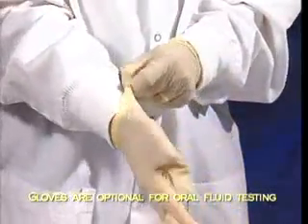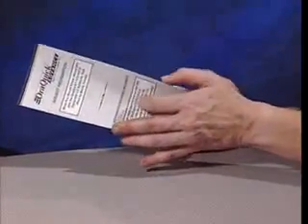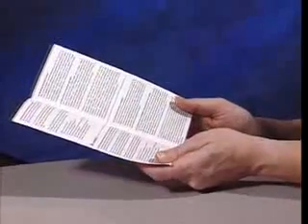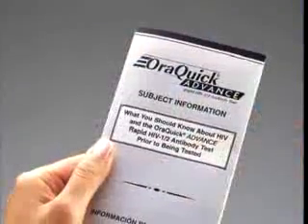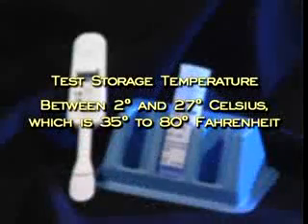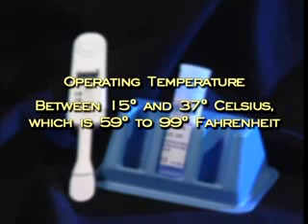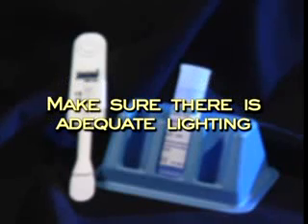Wash hands thoroughly after performing each oral fluid test and after contact with oral fluid. Prior to beginning the testing procedure, provide the patient with the included subject information pamphlet that contains important information about HIV/AIDS and the AuraQuick Advance Rapid HIV-1/2 antibody test. This test may be stored between 2 and 27 degrees Celsius (35 to 80°F); however, allow the test kit to come to operating temperature — 15 to 37 degrees Celsius (59 to 99°F) — before it is used. Make sure there is adequate lighting where the test is being conducted.